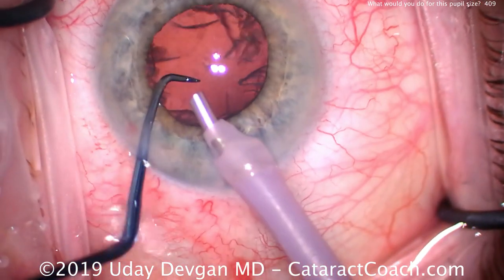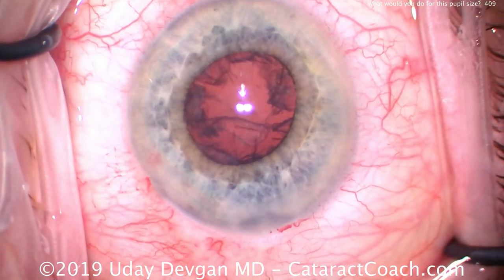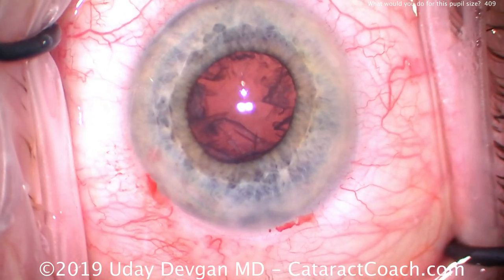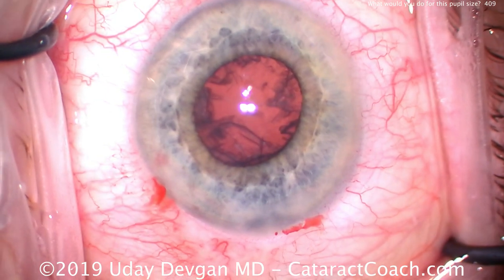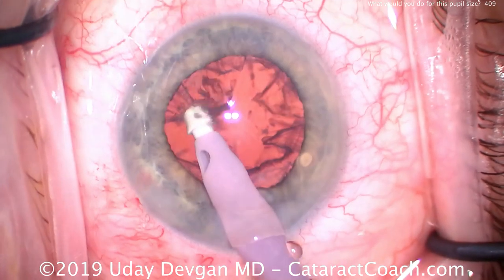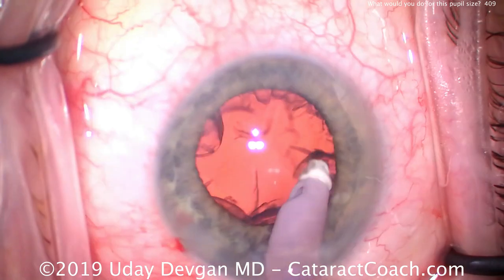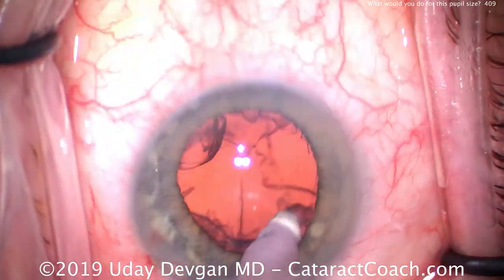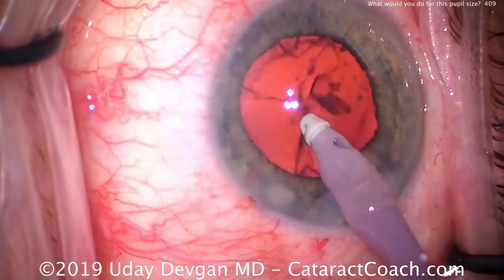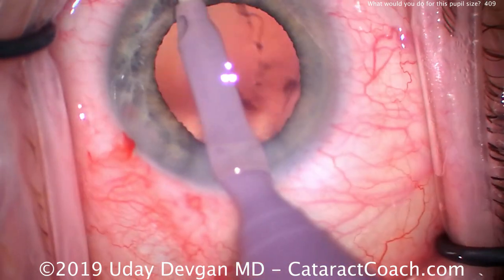The last bit of the leathery material is being removed — no more nuclear chips — and now we're ready for cortex removal. You can see the pupil has now come down just a little bit smaller. In performing the irrigation-aspiration, we want to be very careful to remove all of it because we don't have a direct view of 360 degrees of the capsule bag equator. We remove as much as we can. The infusion pressure, which is a little on the high side, has been used to help expand the pupil.